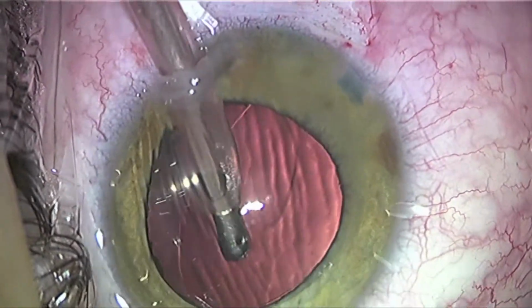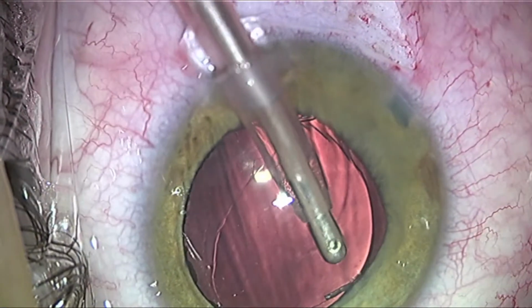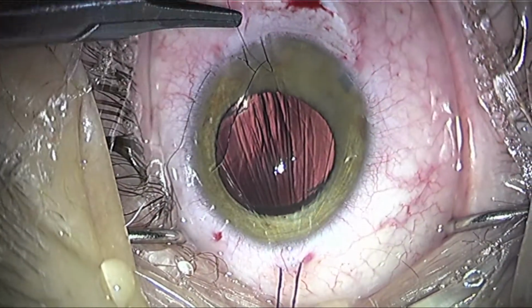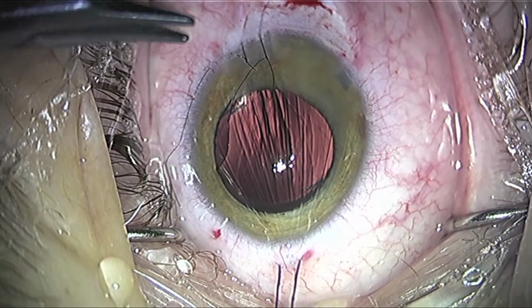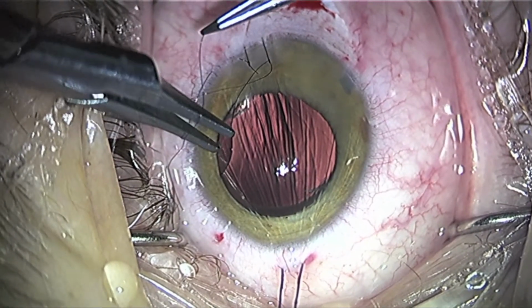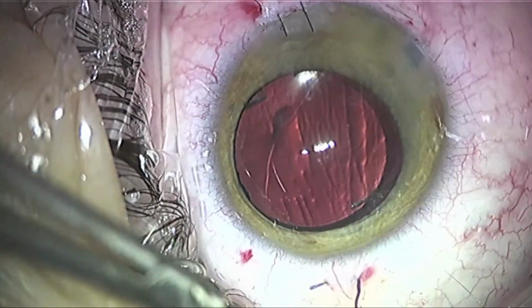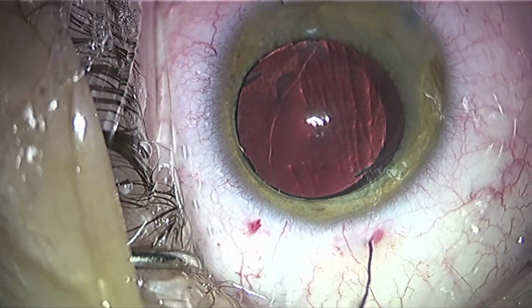The viscoelastic was then removed from the eye, and I chose to place a few 10-0 nylon sutures to close that large wound. At the end of the case, everything looked well centered and stable.